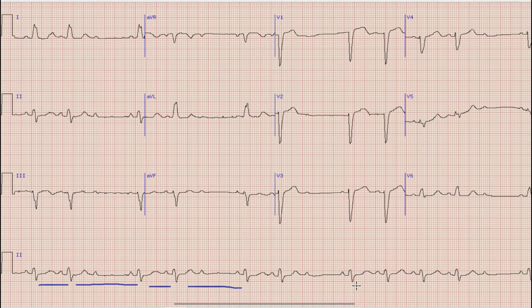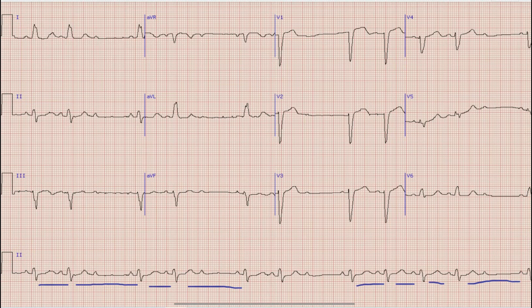Now normally in a sinus rhythm you find a regular RR interval, meaning the distance between two R waves should be equal. However, here we can see that the RR interval is variable — between these two beats and the next two beats, and here the RR interval is smaller compared to the next. There is also a normal RR interval followed by a very prolonged RR interval. So what is the reason for this variability of RR interval?